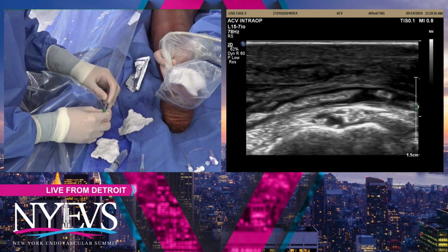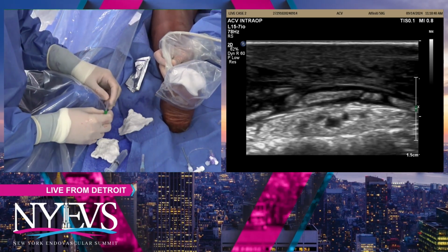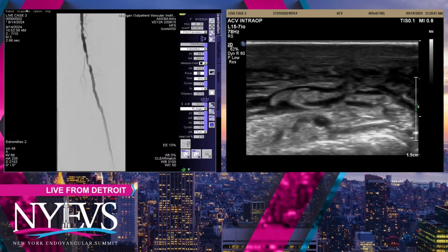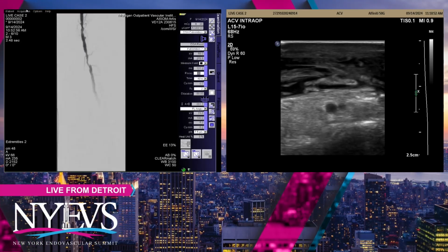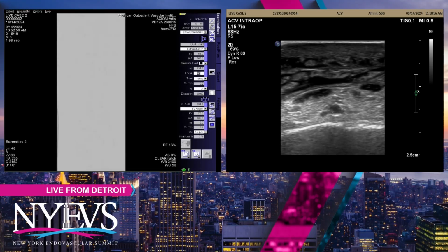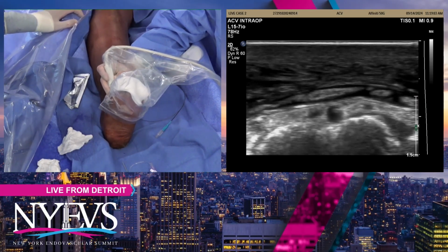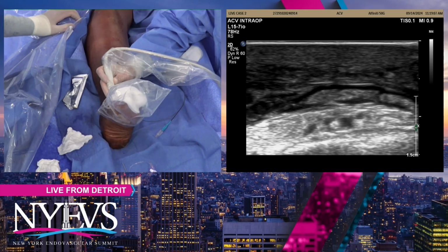So obviously, when you're trying to think about a heel wound and you're trying to get a heel wound to heal, you're concerned about the wound angiosome that you're trying to perfuse, and so it looks like there's above the knee and below the knee disease. Ideally, if you can get direct flow to the posterior tibial artery to really increase perfusion to the heel, that would be ideal. So it looks like trying to cross that. Ideally, I'd probably try to see if I can get some PT direct flow to the heel, but also treat that inflow lesion just to start.